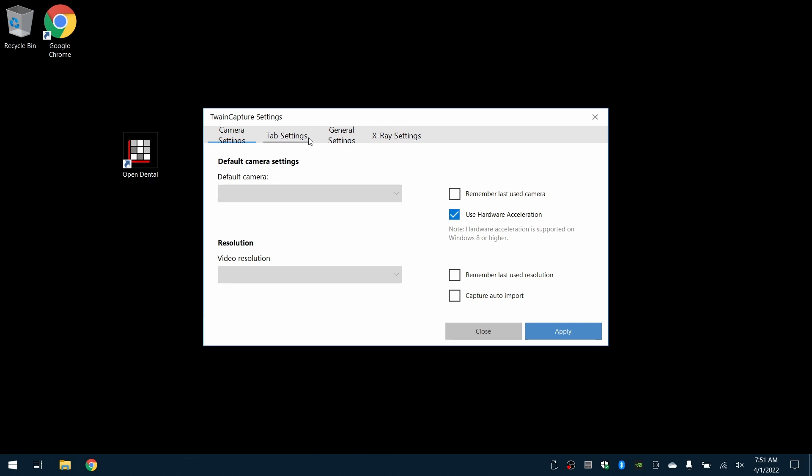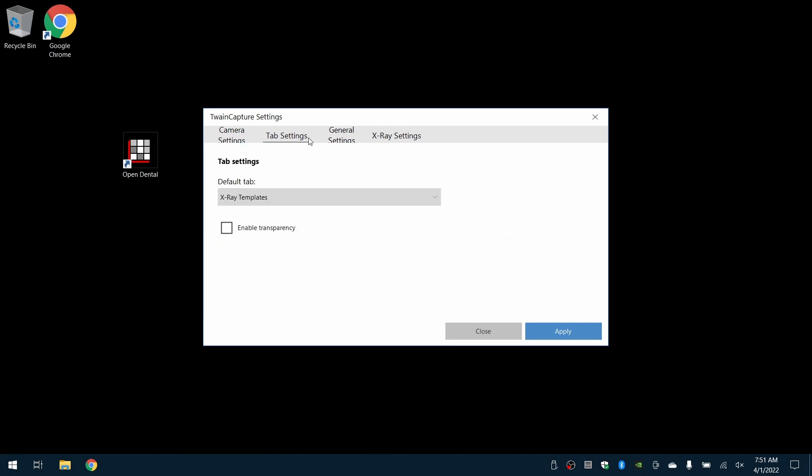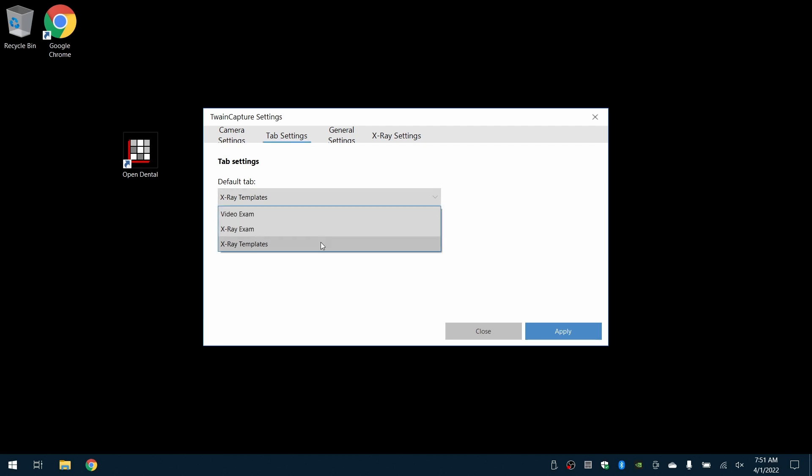Under Tab Settings, we'll ensure that the default tab is set to X-Ray Templates.